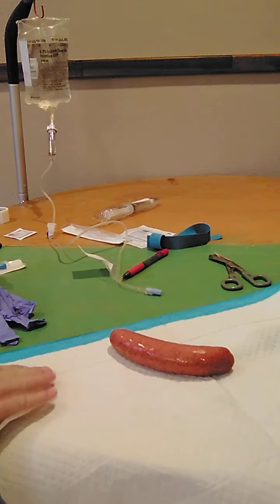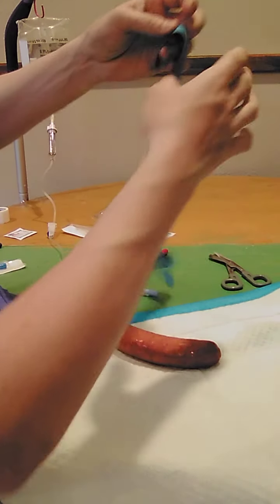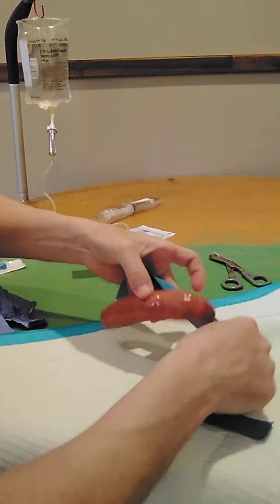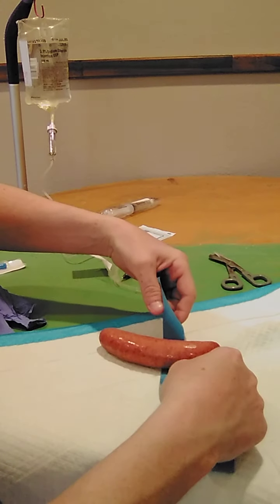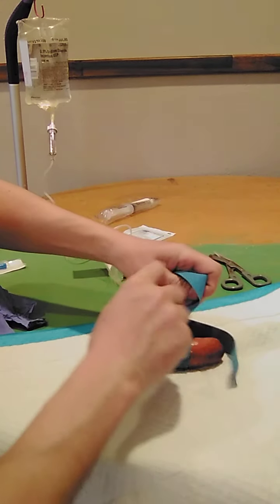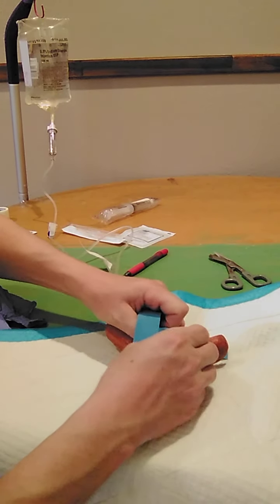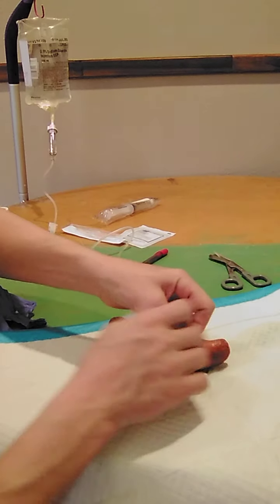So I've got the patient's arm here. I'm going to tourniquet this. So I'm going to apply this tourniquet 4 to 6 inches above the ideal IV site, and choosing an IV site that is not above a joint.